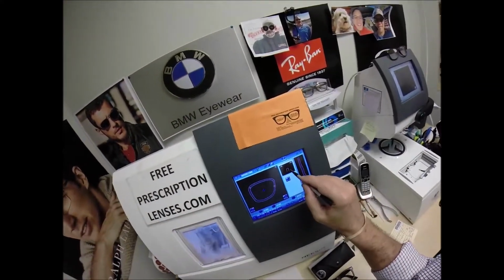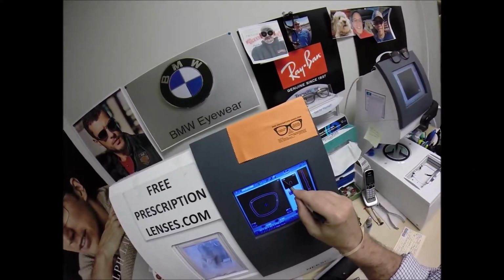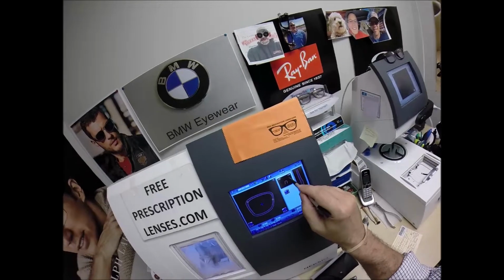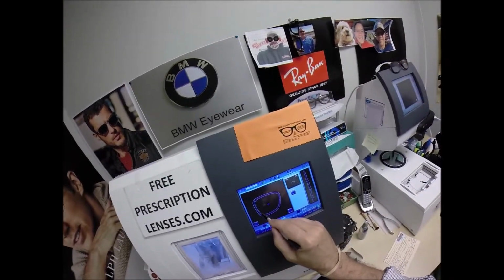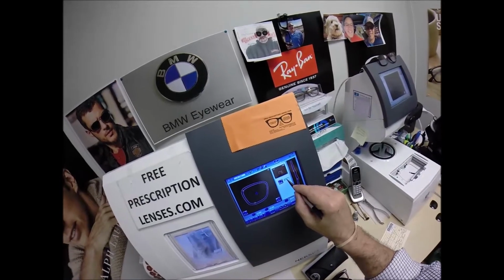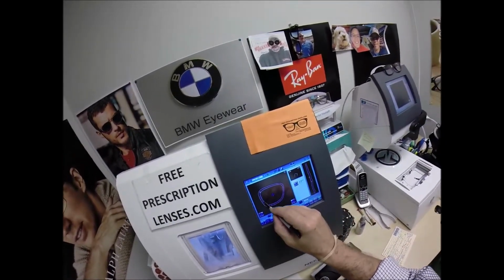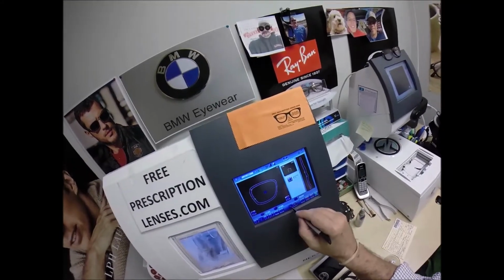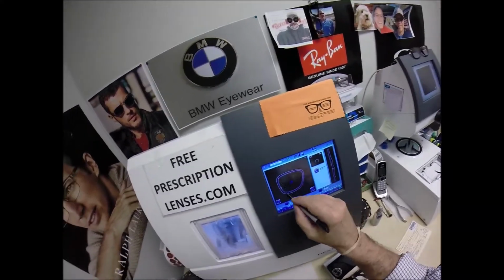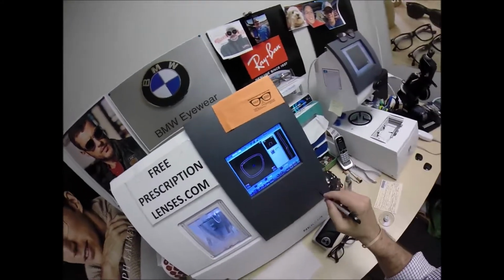So right now it's going to place it in the middle, which right here at the top corner would be 1.26 millimeters in the front, 1.4 in the back. And it pretty much divides it in half, but I could cut it on the base curve, which is 4.30, but instead I'm going to put it on the front bevel, and I actually want it to be about 110. Let's do 120 all the way around. So we have the same thickness in the front.